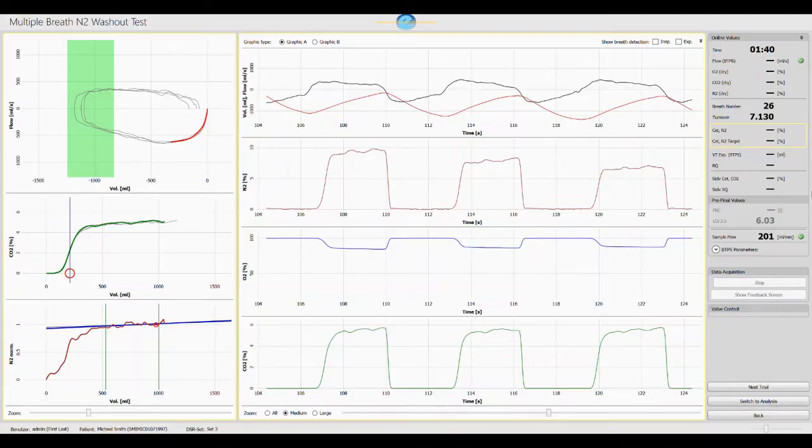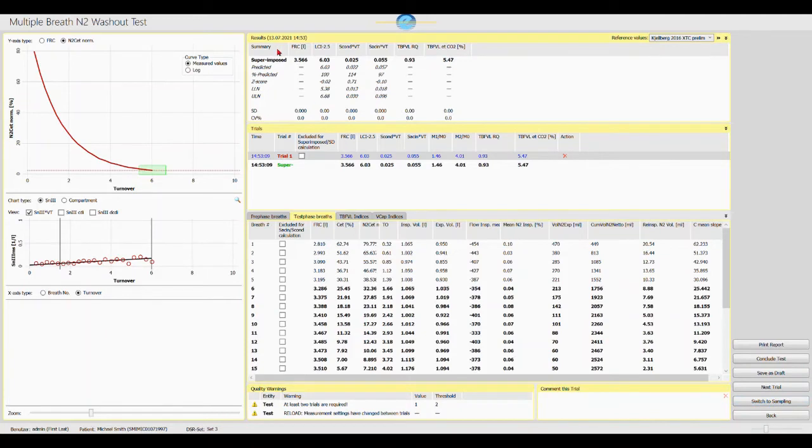Now we switch to the results. The results screen is divided into the summary section, the trials section and the individual breath section. In each section it is possible to display additional parameters by clicking on the chevron. The window at the bottom displays any quality warnings which are recognized by the software, for example if the inspiratory flow exceeds the bypass flow so that the subject breathes ambient air.